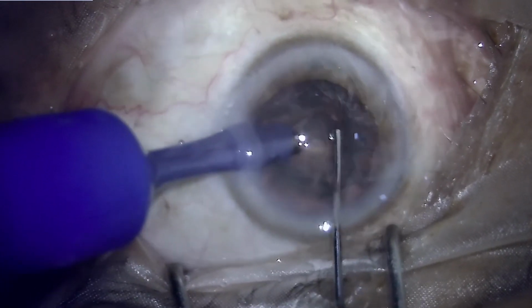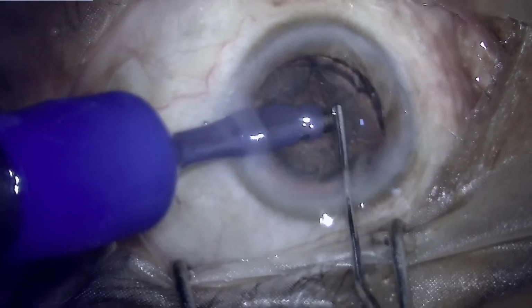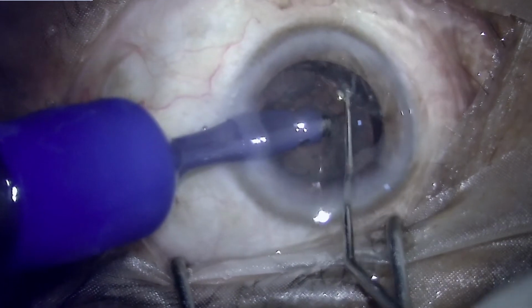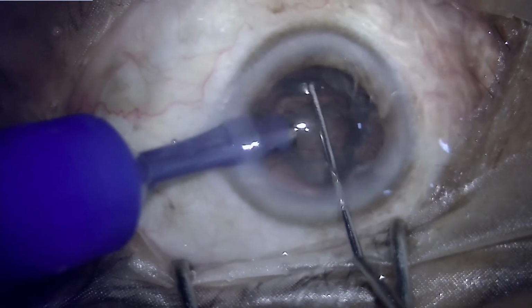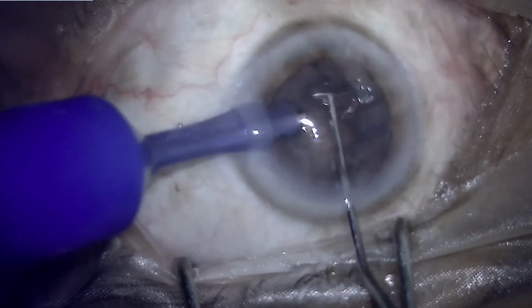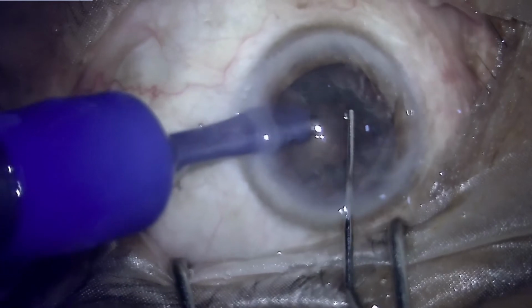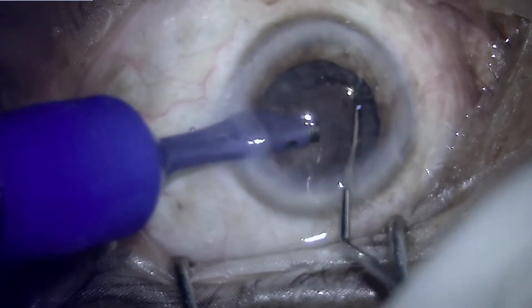So a clay nucleus like this simply detaches, the piece which you hold on to detaches itself, and you are left with a large crater in the center after repeatedly trying to catch hold of the nucleus for attempting to crack it.